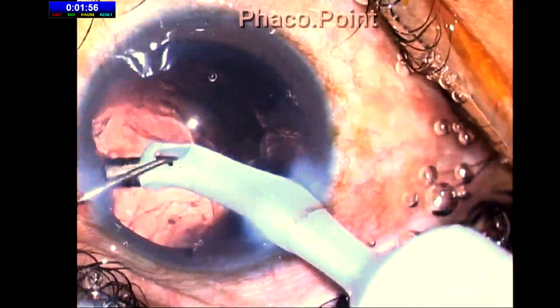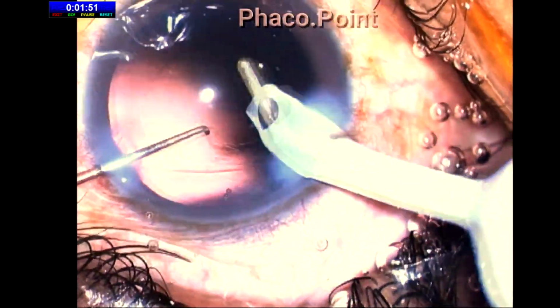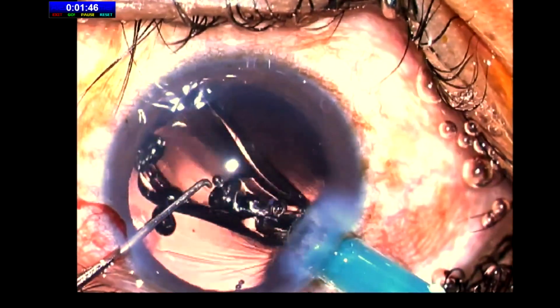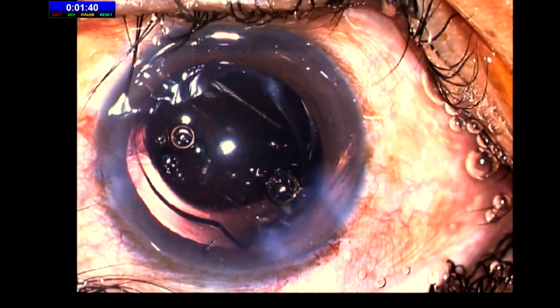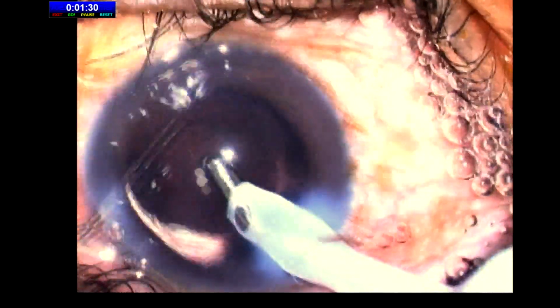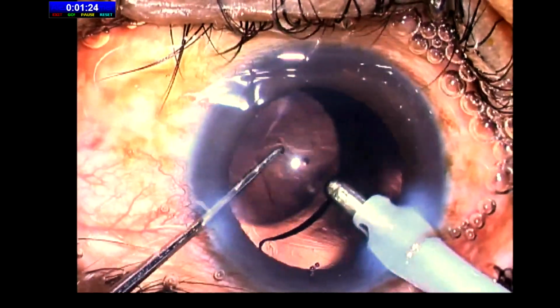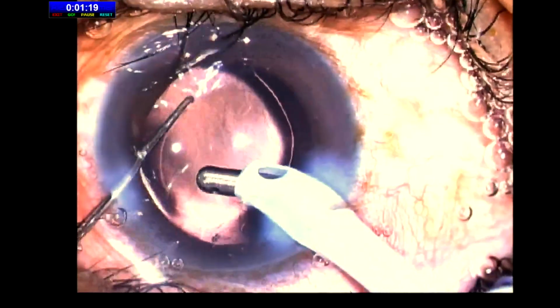The cortex was removed using the coaxial IA, after which a monofocal IOL was implanted in the bag. And here's where the challenge started. Some excessive force was used to draw the trailing haptic within the capsular bag. After washing the viscoelastic from the anterior chamber, the IOL was tilted up and the visco was washed from underneath the IOL. Up to now, everything seems okay. But once this was done, the IOL decentered.